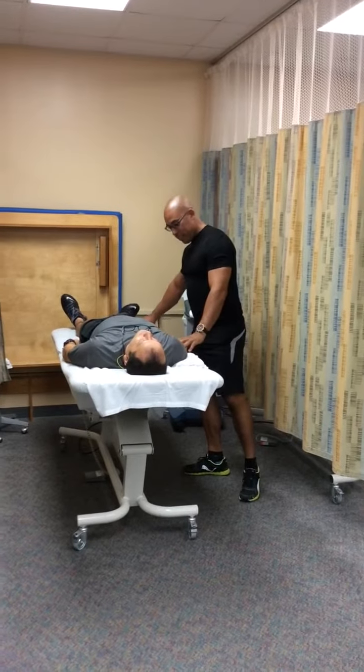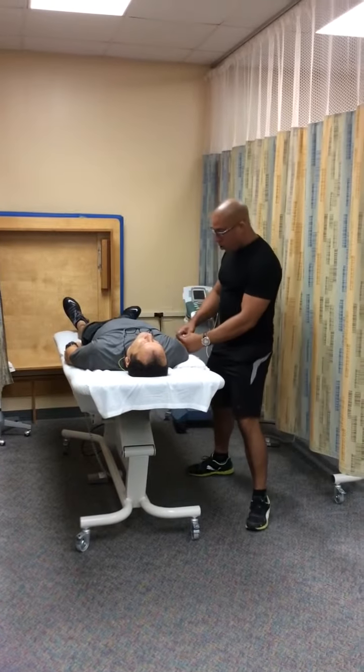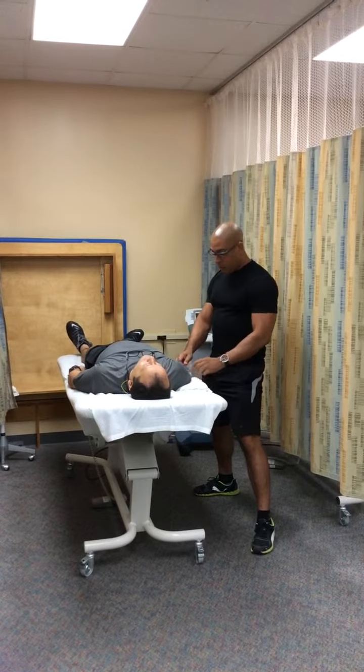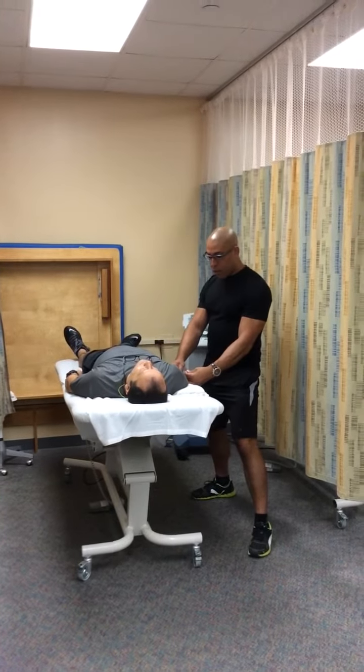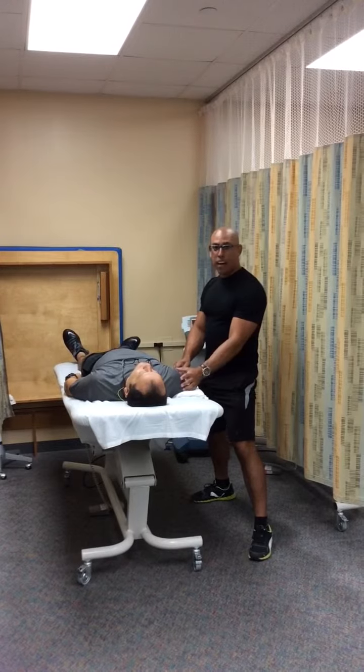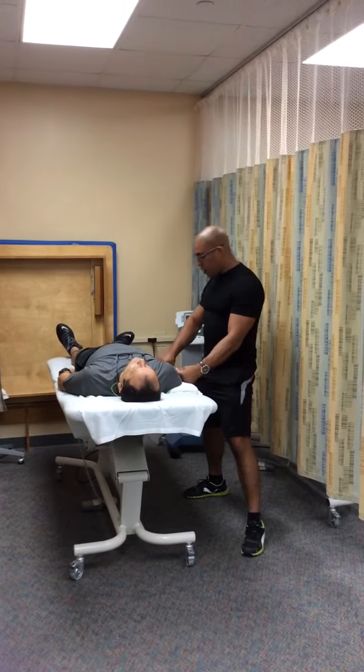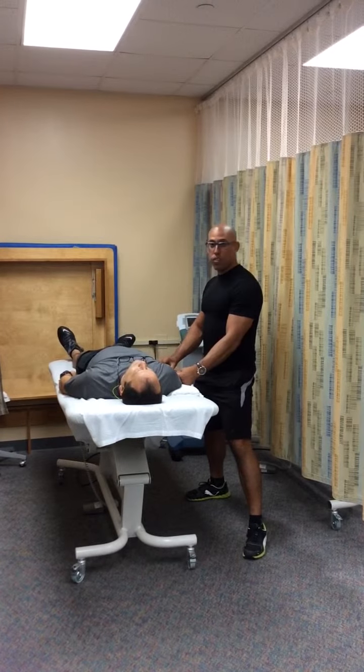I'm going to align the goniometer using these landmarks: my fulcrum on the lateral epicondyle, my proximal arm toward the acromion process, and my distal arm toward the styloid process of the radius.